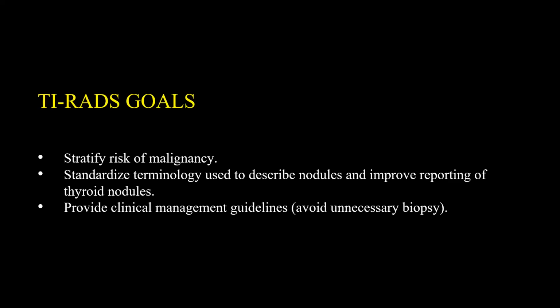Number 1, it stratifies the risk of malignancy. Number 2, it does standardize terminology. So if I give a thyroid report in New York, somebody in California will be able to understand where I'm coming from. And one of the most important things is to provide some clinical management. Are we going to biopsy or are we going to watch? This is really important because, as we said a couple slides ago, a lot of these cancers are indolent and may not need any treatment.